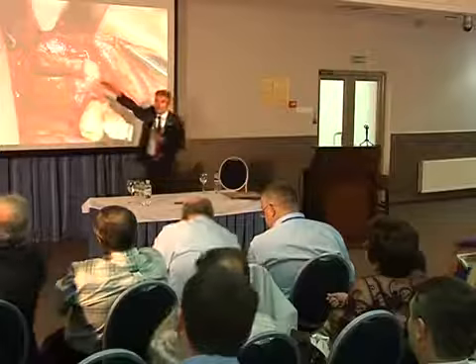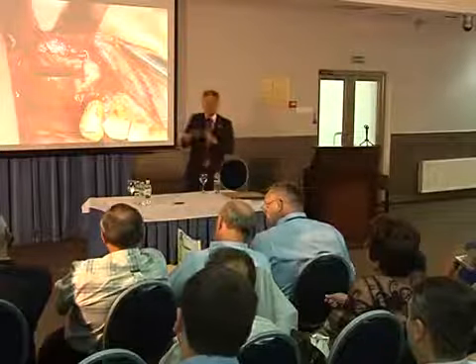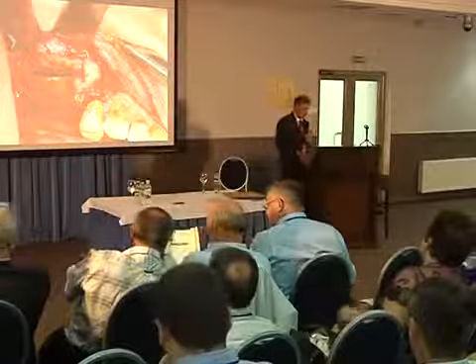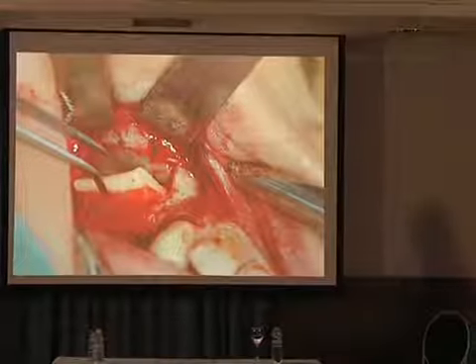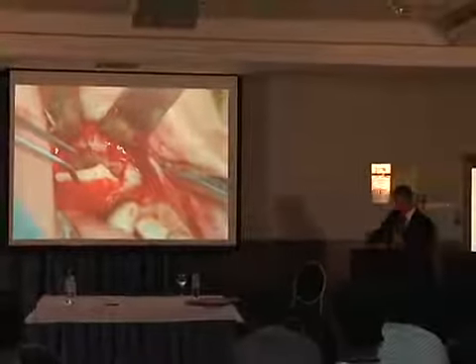How adhesive that is. It's very sticky, right? So the longer you work with that PRGF, the more you see indications, the more you play with that, the more you are happy when you go in your operation room. Чем больше вы будете работать с этими материалами, тем вы больше будете видеть возможности, которые вам открывают применение методики использования вот этой мембраны. Bone block inside.